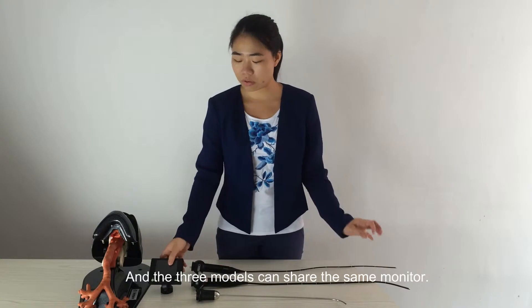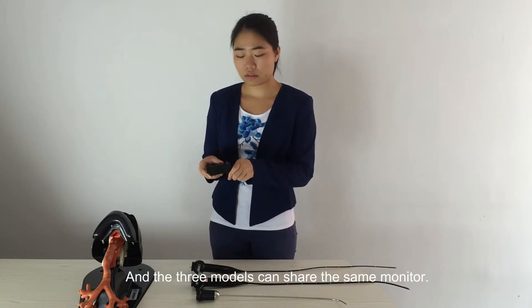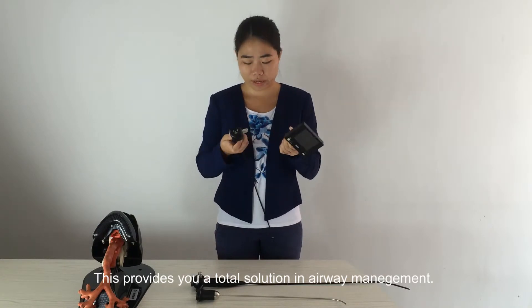The three models can share the same monitor — that is to say, the monitor is compatible. This provides you a total solution in airway management.